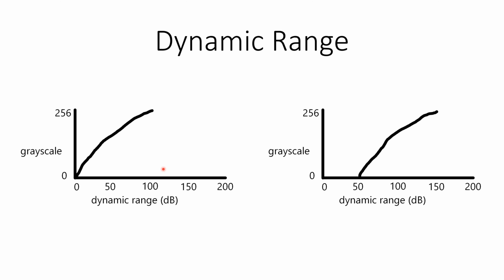But really high intensity, loud sounds are all just going to be whited out, snowstormed out. You're not going to be able to distinguish between something with a loud sound intensity and something with an even louder sound intensity. On screen right, we're ignoring everything in the low dynamic range setting.